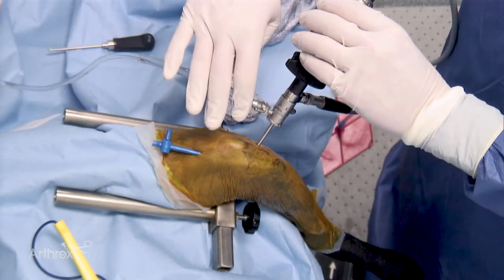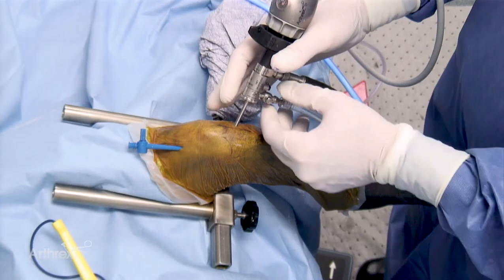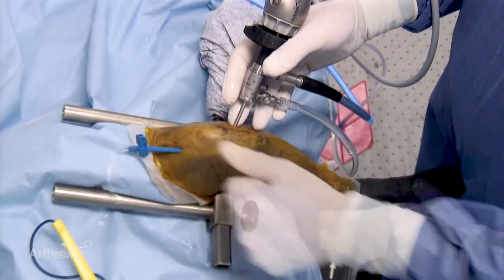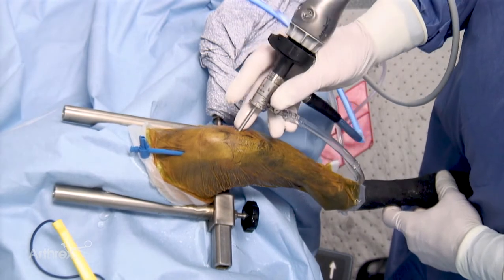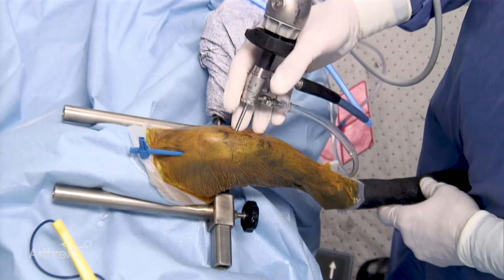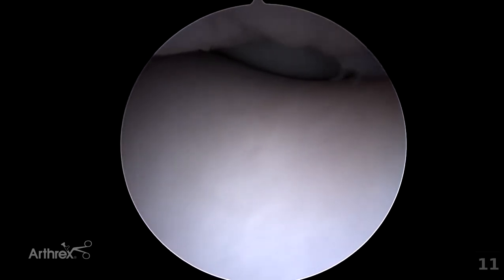This port can be opened and fluid flow commenced. At this stage we should now have early visualisation of the joint. The fluid line leading into the arthroscope is controlled by use of this lever. Fluid flow is now activated and by opening the cannula flow, egress is established. Egress can be controlled by use of the stopcock. Once in this position it is important to maintain scope stability. By bracing your scope hand against the skin of the patient it allows you to control the scope without inadvertent insertion or removal.